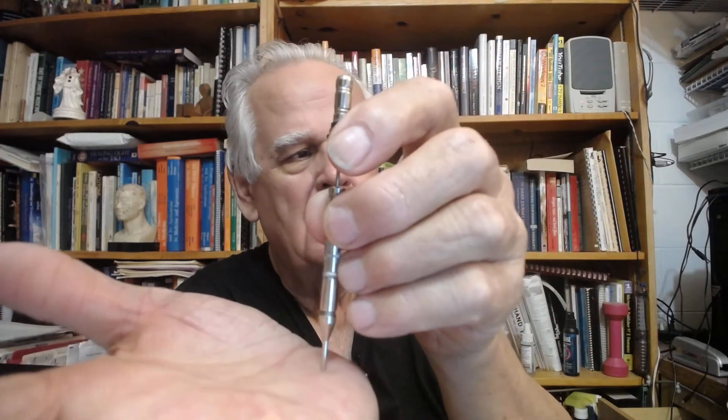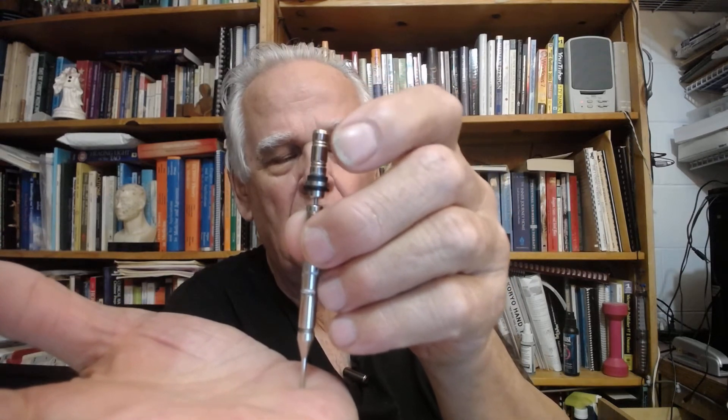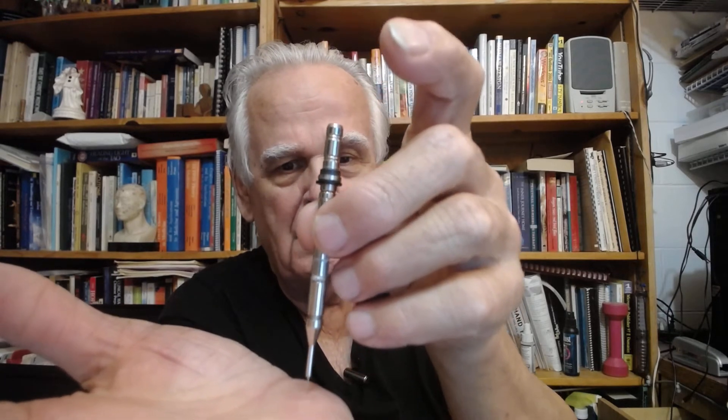So then all you have to do — I'll show you here — is put it on the hand, or wherever you're going to do it. Let it go. Now sometimes, if it's a callous tissue, you may want to do it a second time, and then lift it off, and there you have it.